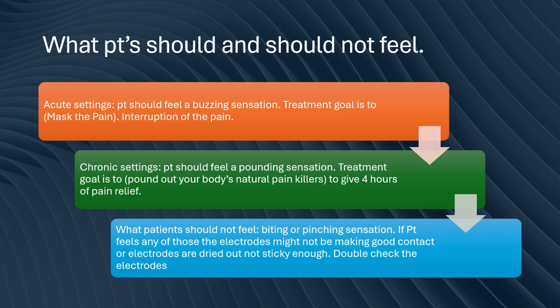And then the patient should not feel any type of biting or pinching sensation when placing the electrodes on. If they do tend to feel that, it means it's not making good contact and the electrodes may be dried out, where you'll have to sprinkle some water on there so they're not so dried out, and you'll want to double check and make sure the electrodes are making good contact with the body.